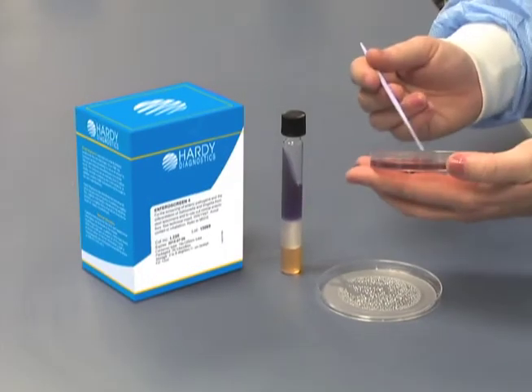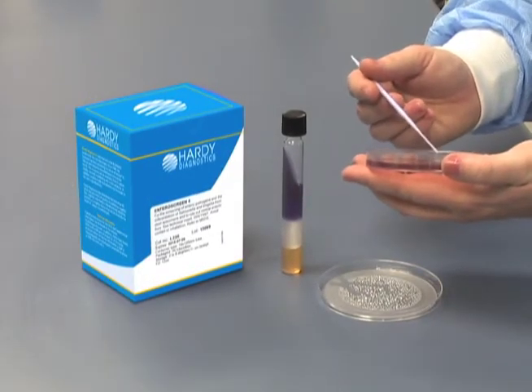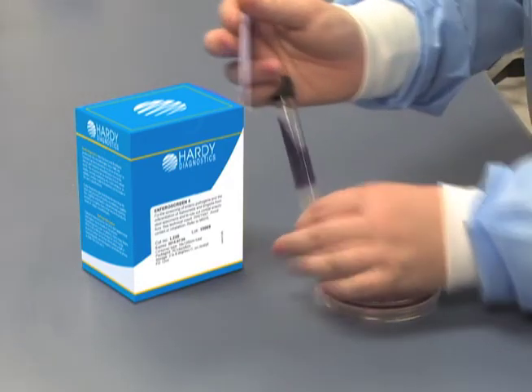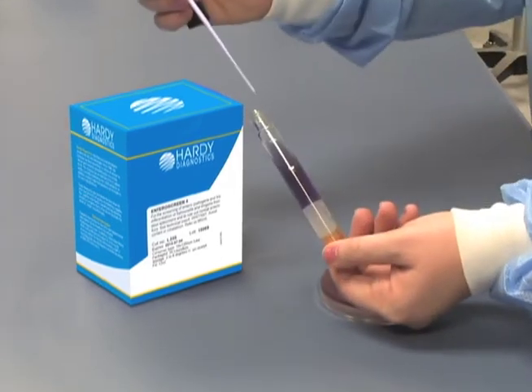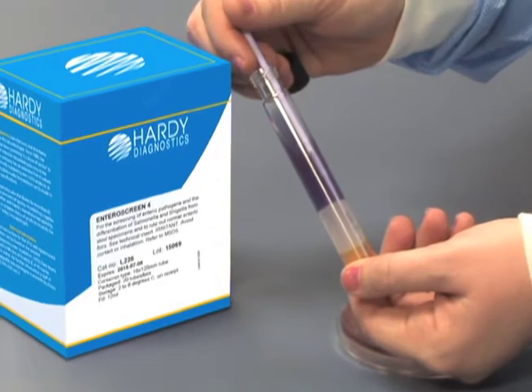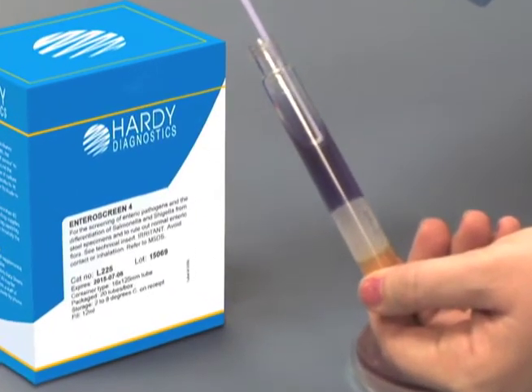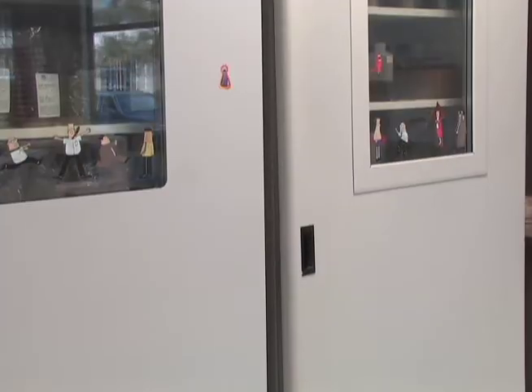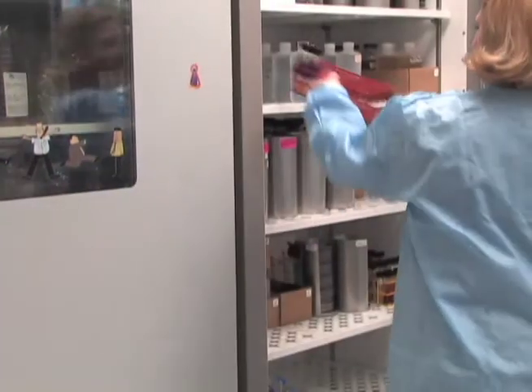Here's how it works. Select your lactose-negative colony from your McConkey or similar plate using an inoculating needle. Stab the needle to the bottom of the tube and streak the slant portion while withdrawing the needle. Incubate the tubes with loose caps at 35 degrees centigrade overnight.